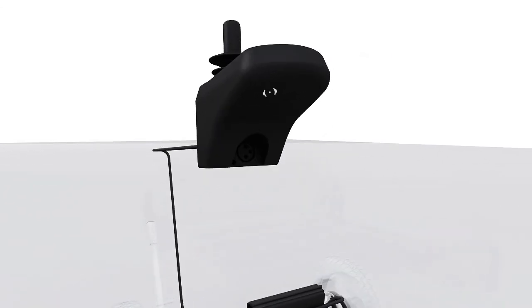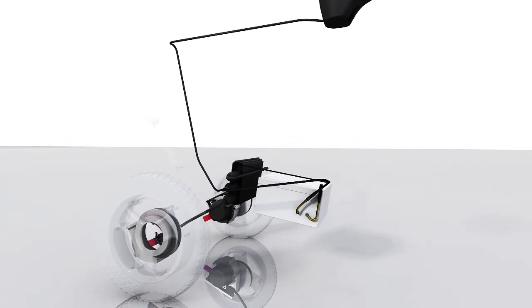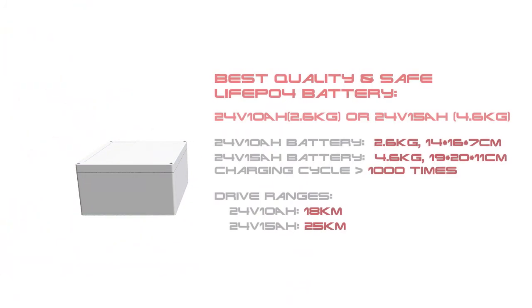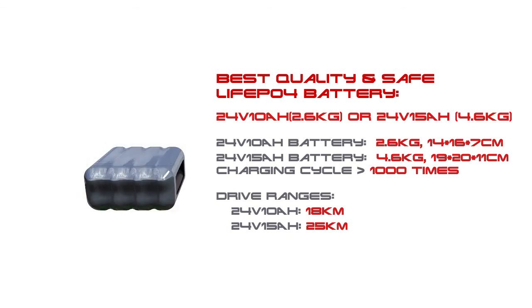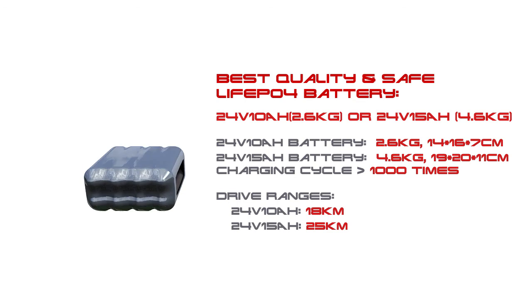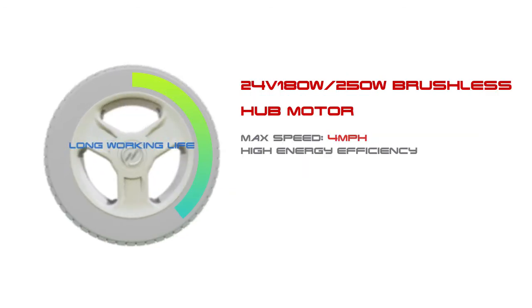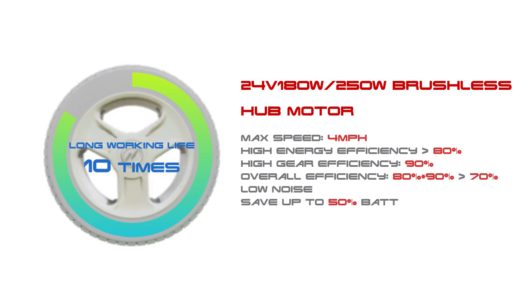Charger port 1 and Charger port 2 provide flexible charging options. The chair is equipped with a best-quality LiFePO4 battery for long-lasting, safe power.